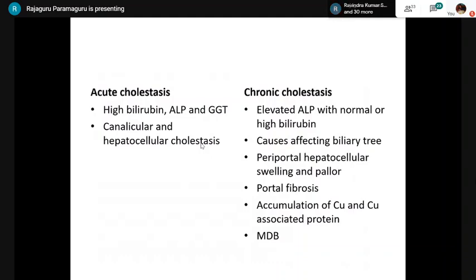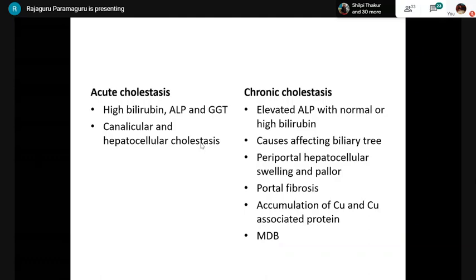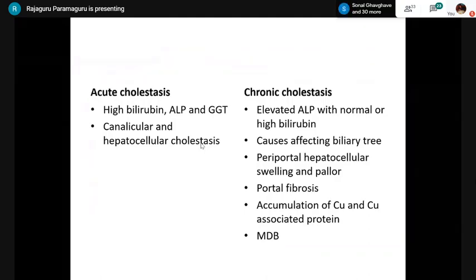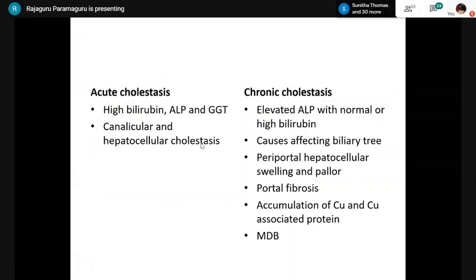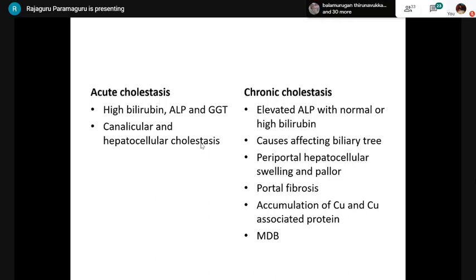When dealing with cholestatic liver disease, differentiate acute from chronic cholestasis. Chronic cholestasis is usually related to the biliary tree — ALP will be elevated and bilirubin may sometimes be normal. Characteristic changes of chronic cholestasis include: periportal hepatocyte swelling and pallor with Mallory-Denk body accumulation, periportal fibrosis (cholate stasis), and copper and copper-associated protein accumulation in periportal hepatocytes. Rodanine stain demonstrates this copper accumulation in periportal hepatocytes in chronic cholestasis.